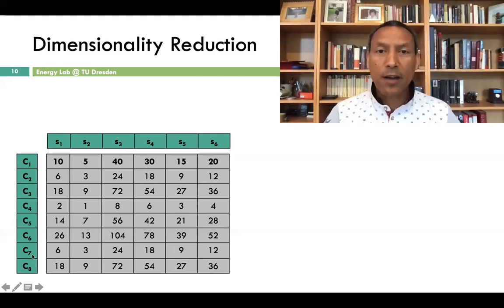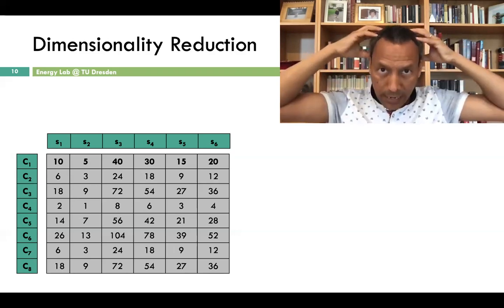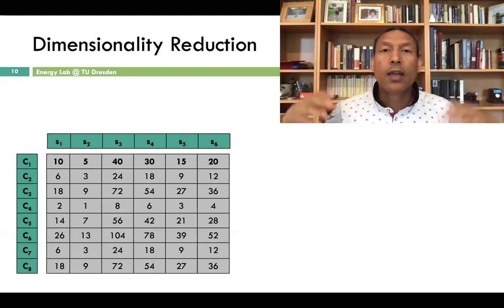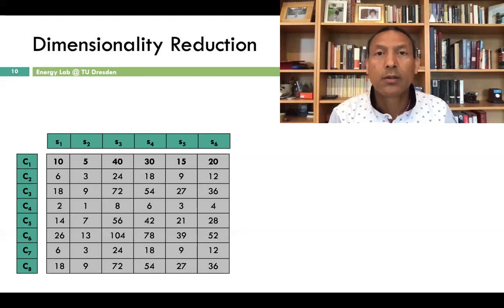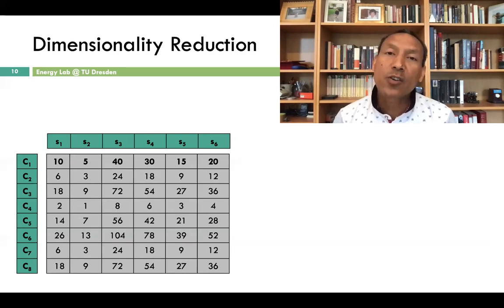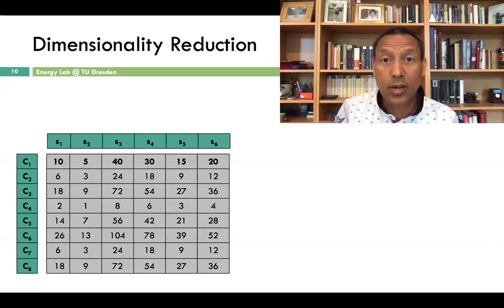For example, we have used electrocardiogram, electroencephalography, electromyogram, oximeter, and many other sensors to monitor a patient. And we synchronously sample these channels. C stands here for channels or device.